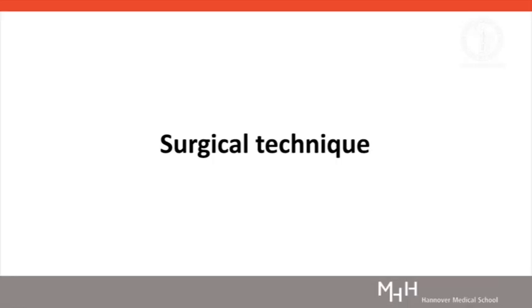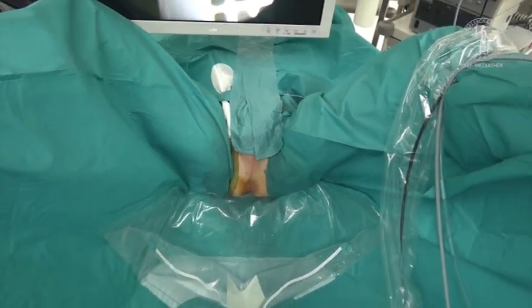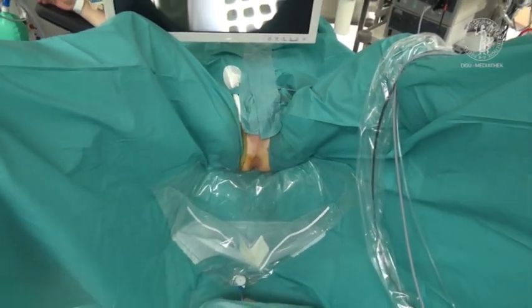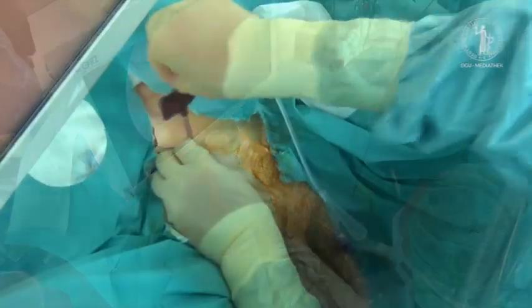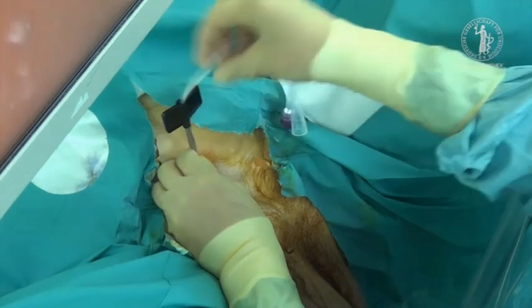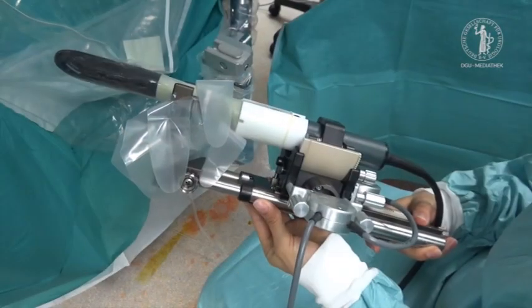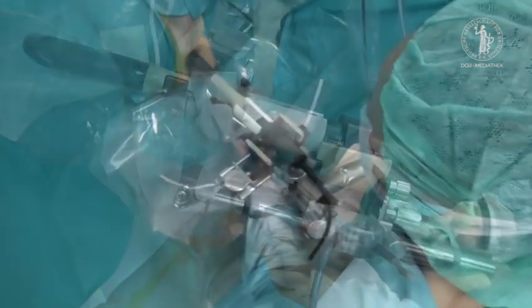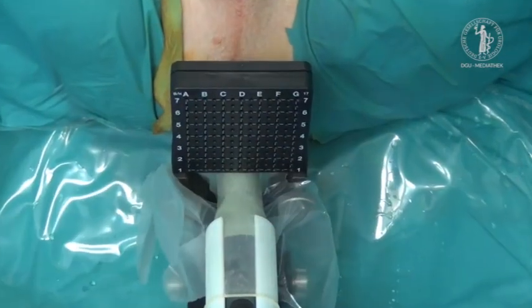The patient is positioned in a lithotomy position for a transperineal approach under general anaesthesia. At the beginning of the procedure, a cystoscopy is performed and a suprapubic catheter is placed. Afterwards, the transrectal ultrasound probe, fixed on a stepper system, is positioned in the rectum and the template is fixed.